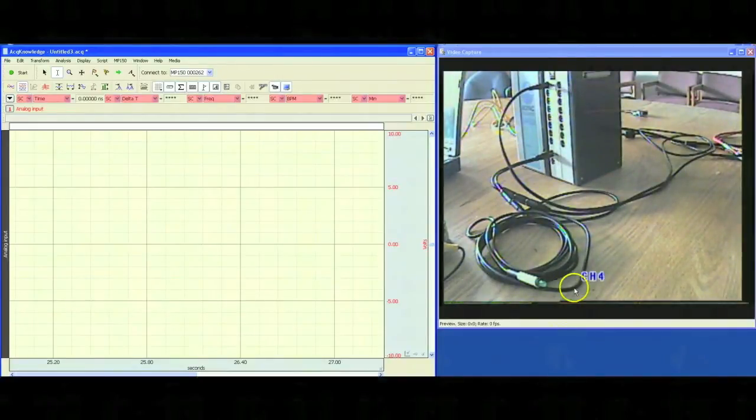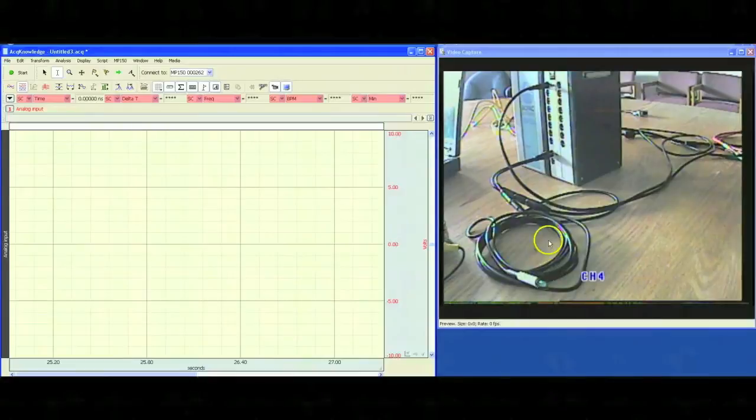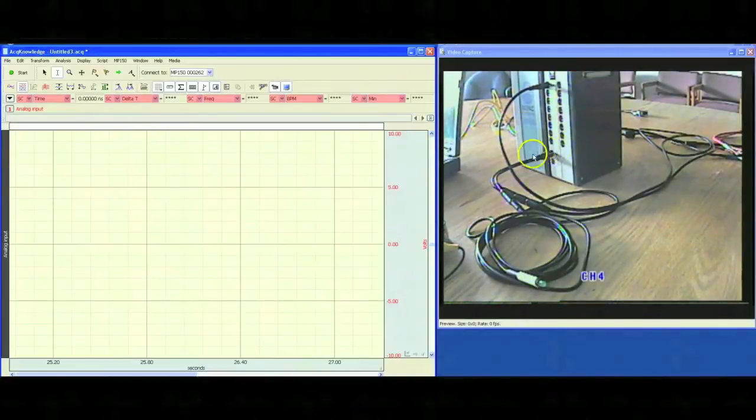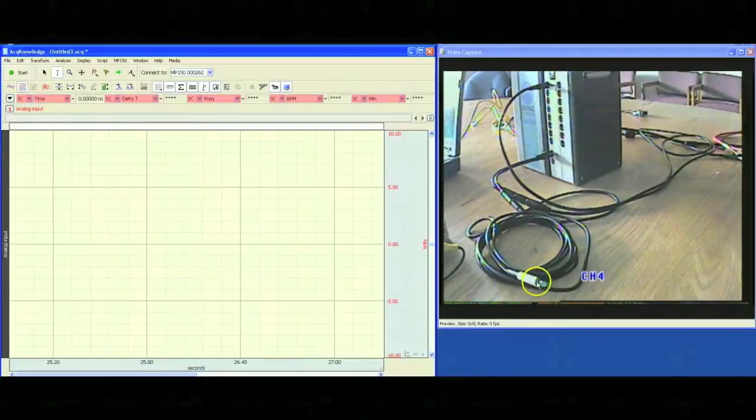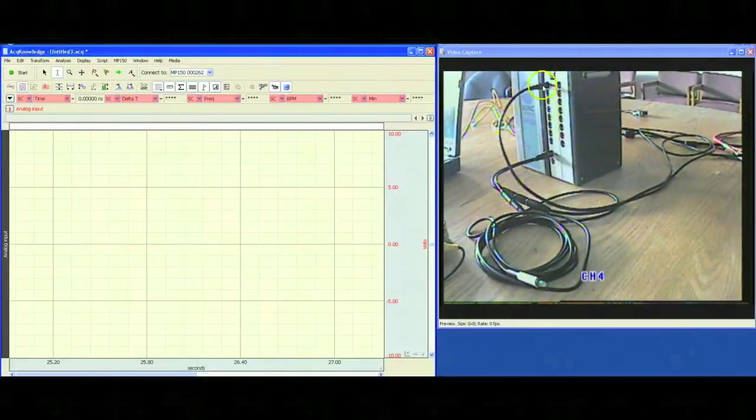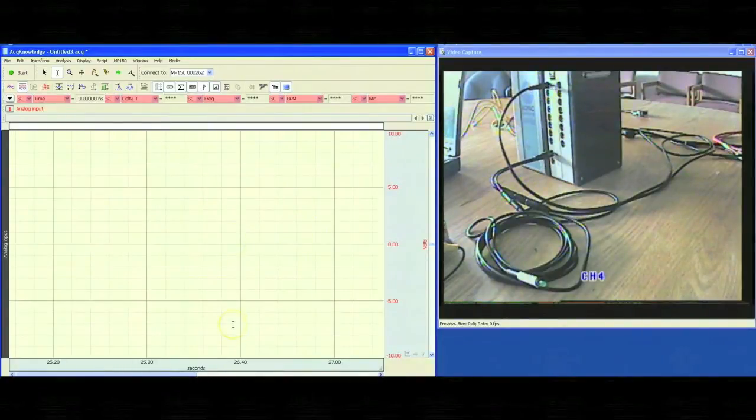From here, we can now see that there is an LED light and the MP150 system. The MP150 system is going to output to the LED causing it to flash. We are then going to capture this back through an analog channel to see the pulse displayed on the screen.